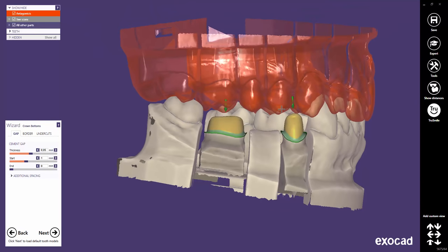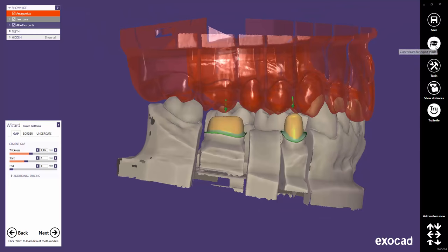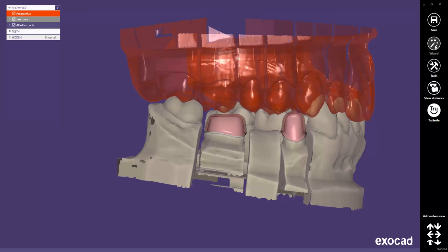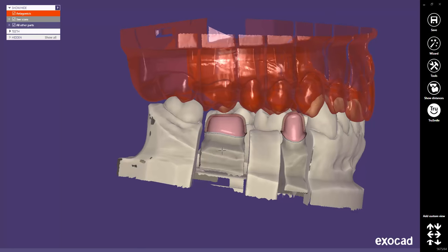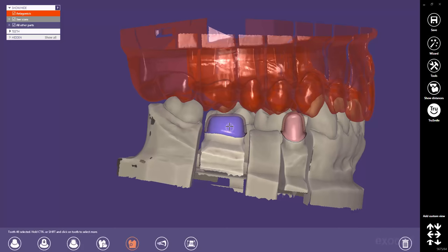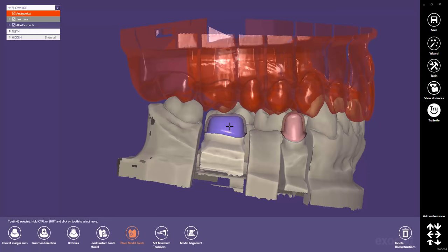If you want to make different settings just for the molar, you have to switch to the expert mode. Then click on the restoration part you'd like to change. A new toolbar appears in the lower area of the screen and the activated tooth will be colored in blue.